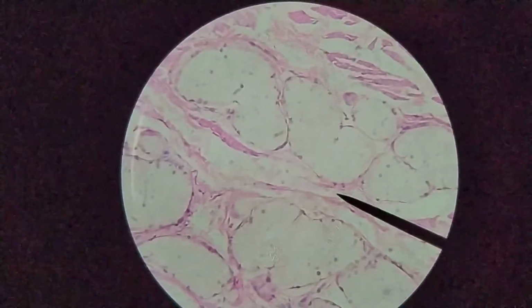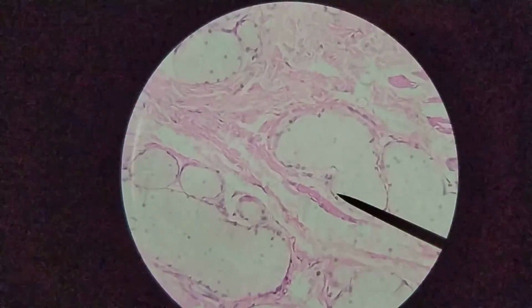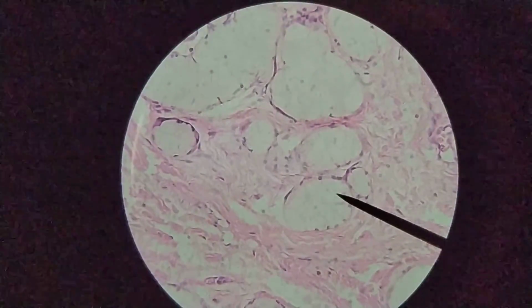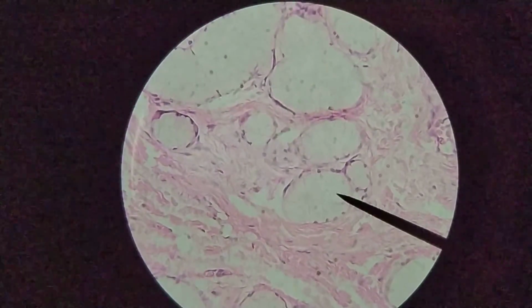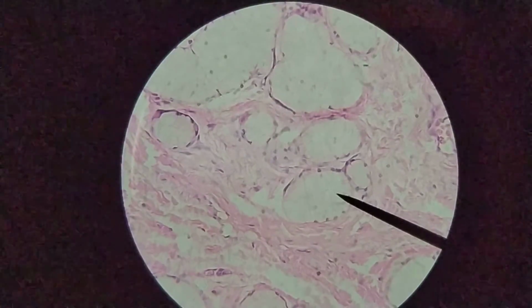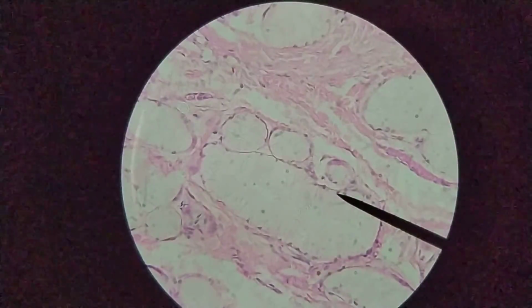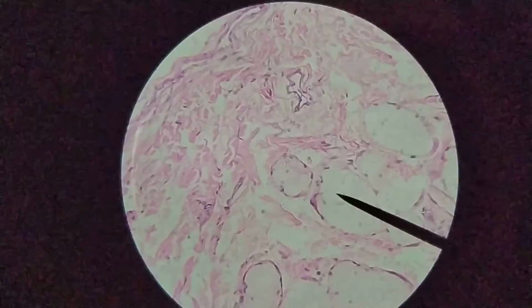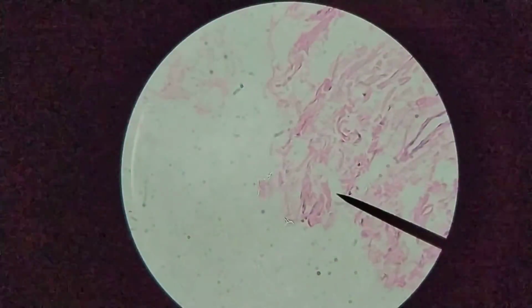Unfortunately, the staining is not very good. You can kind of make it out if you know what you're looking for, that there is a lumen here, and the cells are filled with small granules of mucus wherever you look. Okay, this is a submucosal gland. And again, the rest of the submucosa here.